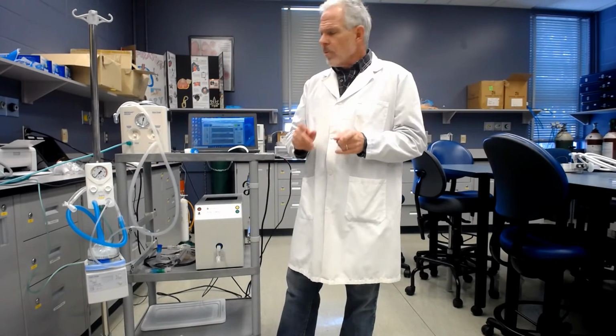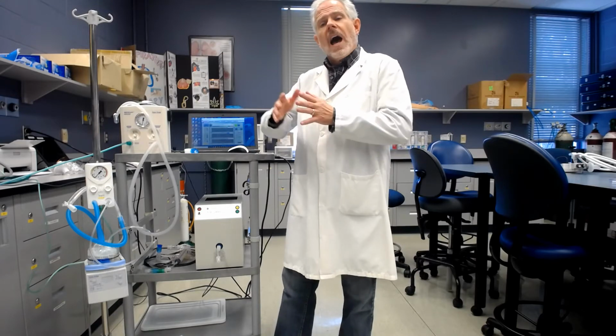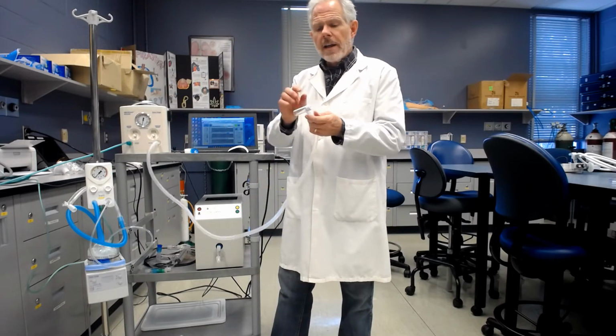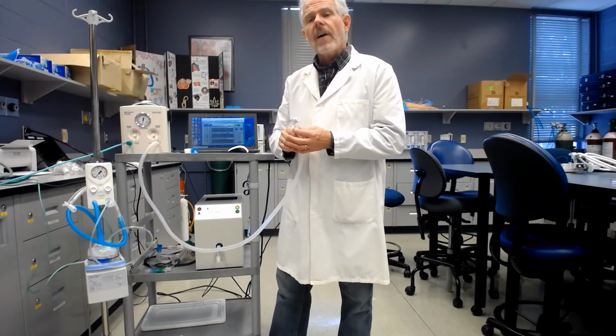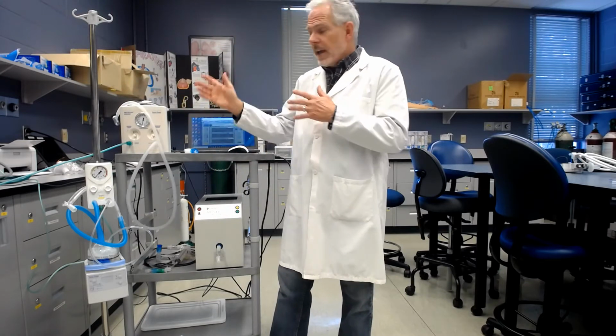All right, what I'm looking for is a couple of different comparisons. One is how much work of breathing, if we're just delivering CPAP, is imposed by the different ventilators, because the baby has to breathe back and forth through the resuscitator, drawing in flow through the device. And I'm going to compare that performance between the Neopuff and the rPAP.